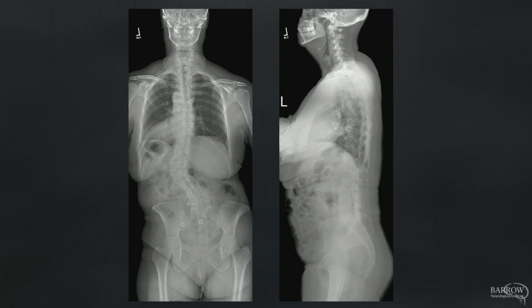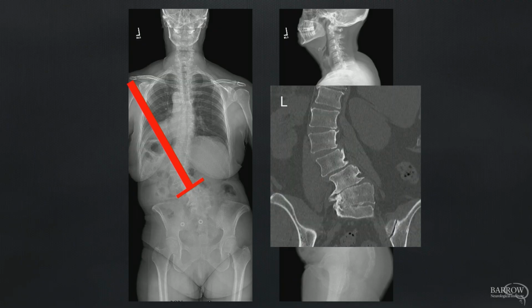And this is an example of a patient with a type C, just to illustrate the concept. You see the patient's pitched over toward the convexity of that primary lumbar curve. The L4 is very angulated there. If you correct that primary lumbar curve without addressing the fractional curve, you're going to actually make that deformity much worse and pitch them further off to that side. So for this patient, you really need to correct that fractional curve.